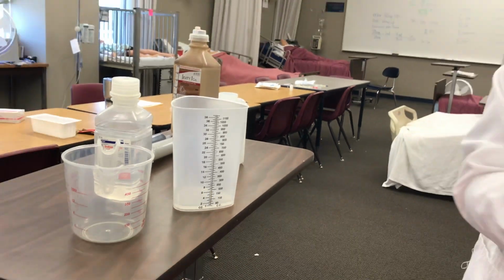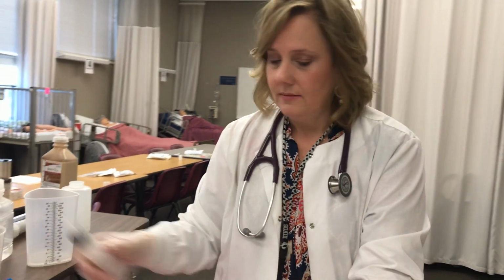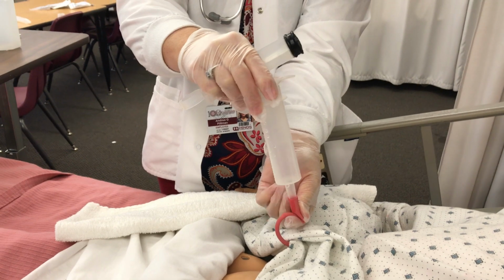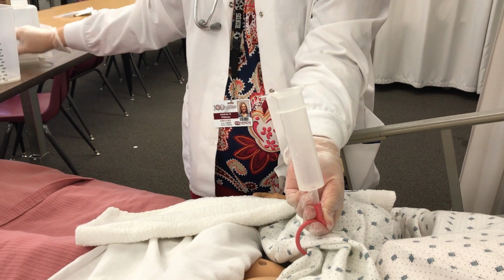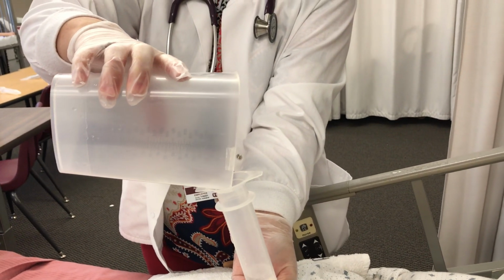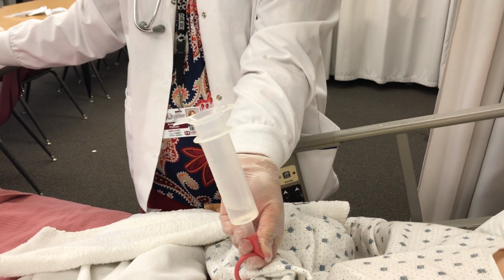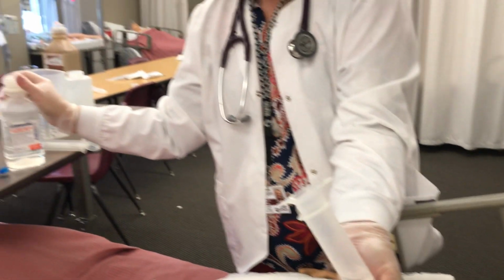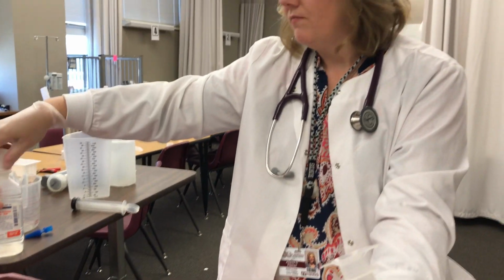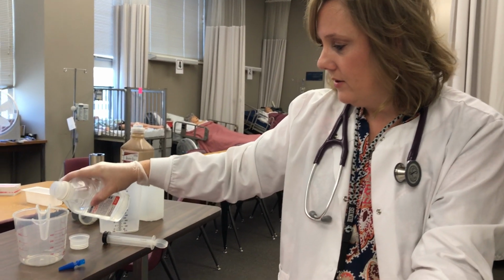It's going to be important now to put that back into the client. So in order to do that, we're going to just put it back in to gravity. You see I still have my tube clamped because I don't want any extra air going in there. I will pour the stomach contents back in. And then at this point, I'm going to flush with 50 cc's before feeding. And so I'll go ahead and get that prepared as well.